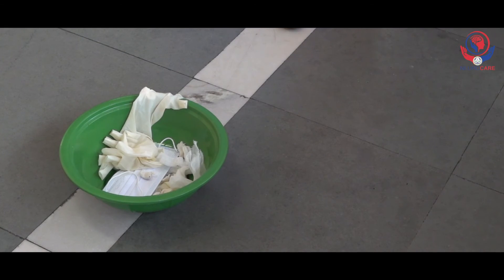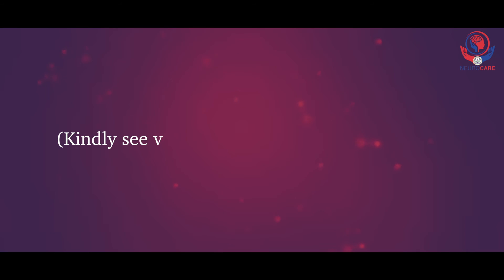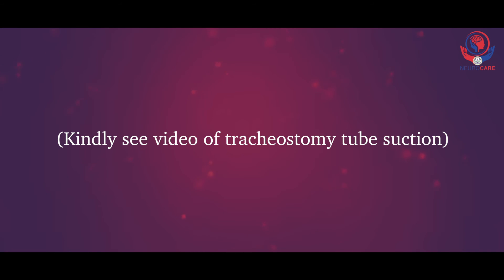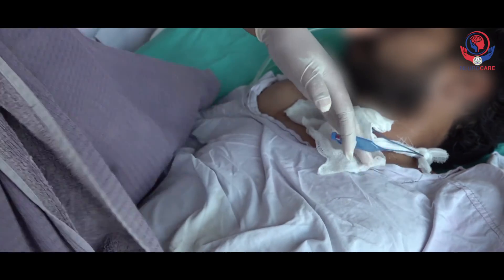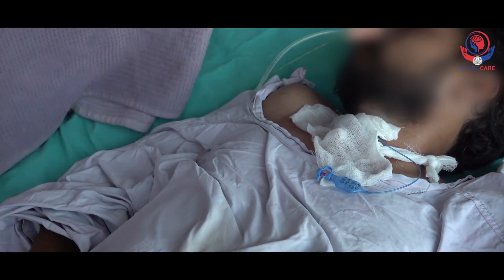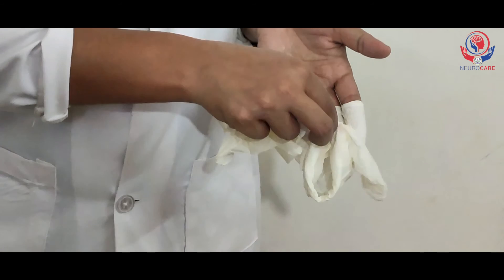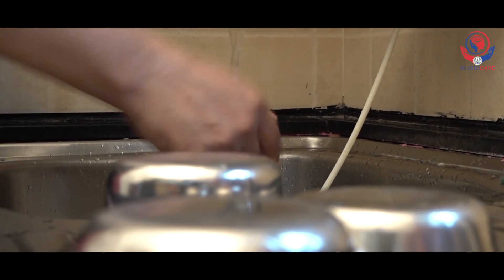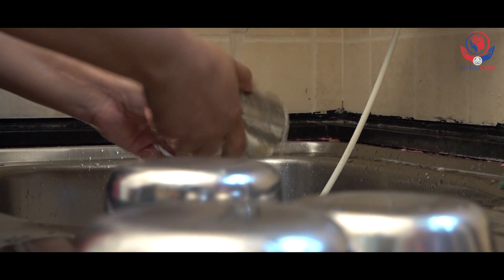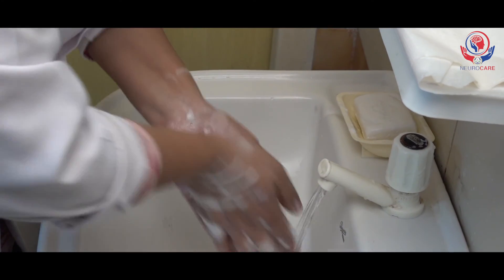Discard all waste into the dustbin. If there is a need, do suction in the tube — kindly see the tracheostomy tube suction video. Cover the tracheostomy tube with a two-layered wet gauze piece. Remove the small towel from the chest of the patient and provide a comfortable position. Remove the gloves and discard them into the dustbin. Wash reusable articles with soap and water and dry them properly before replacing. Wash hands thoroughly with soap and water.